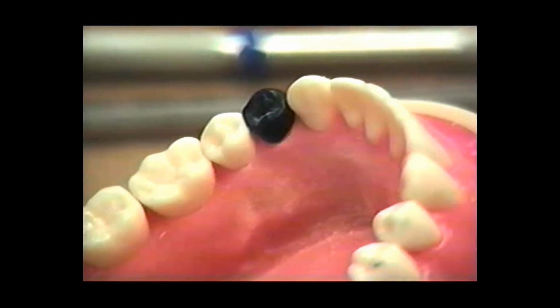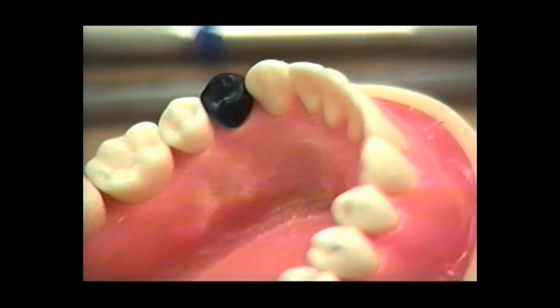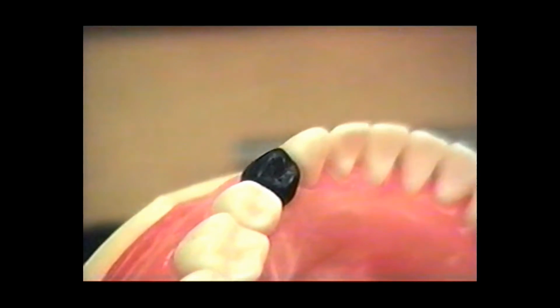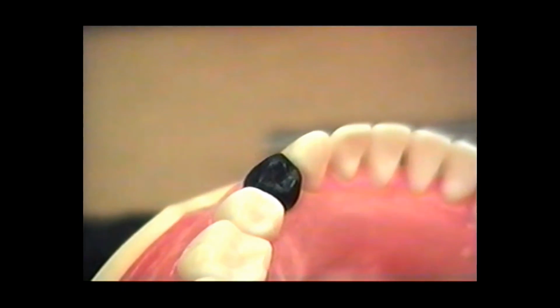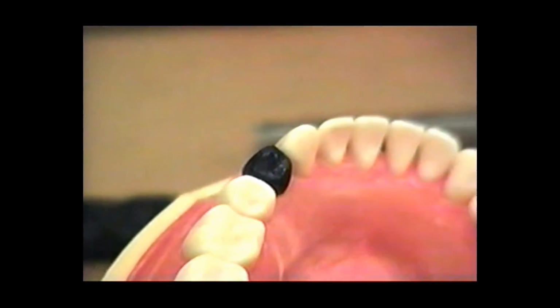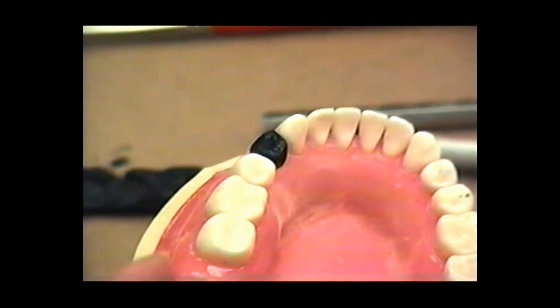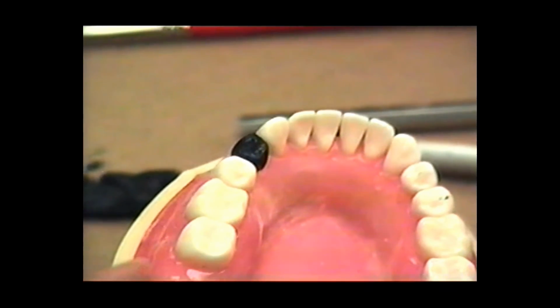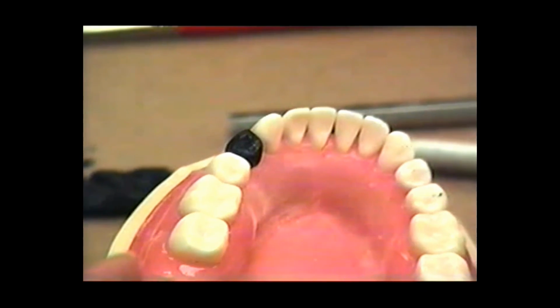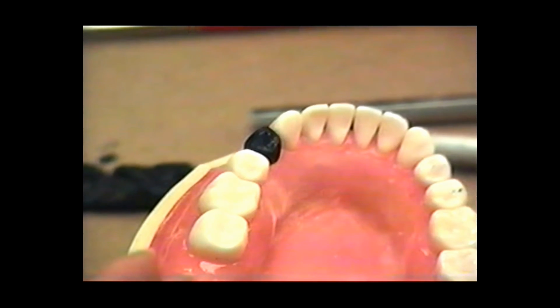What angle do you use, this way or this way, or the stroke that you take out? The question is, how do you know what angle at which to reduce the waxing as you're contouring? It's whatever is convenient for you. If you're taking something off and shaving it away, we learned in that Essentials course that if you're pulling toward yourself, it works better. You have more control of the instrument. So if you're going up and down or sideways or back and forth, it doesn't matter. It's just whatever's going to give you a smooth finish, and sometimes it's driven by where you have to reduce.